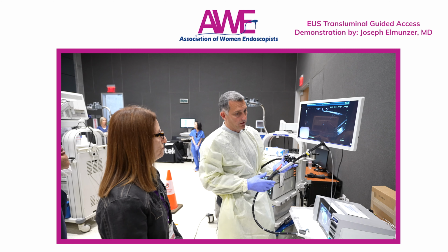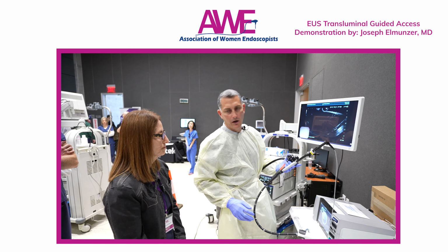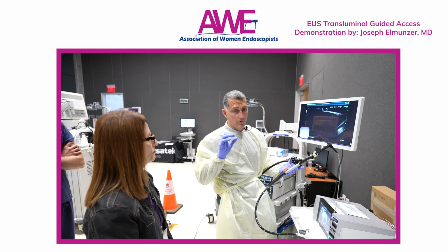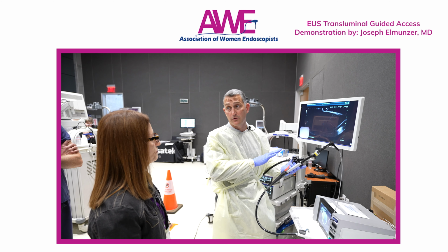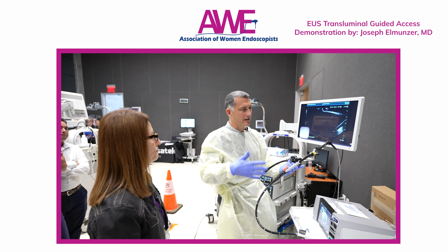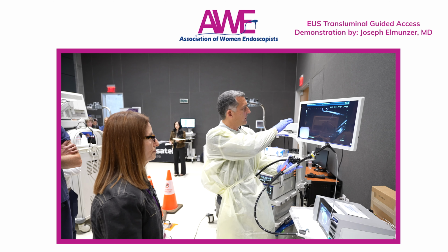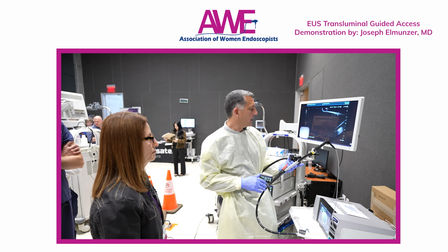Then the next thing we typically would do is check Doppler. We're not going to do that in this non-live model, but you would check Doppler. Typically, before actually stepping on the pedal to burn through, I turn the Doppler off because I think the artifact can be really distracting. I agree. You ideally want to see yourself puncture through as clearly as possible. So for the sake of discussion, we'll say that we have checked the Doppler, that we don't see any intervening vessels, and we're ready to go.